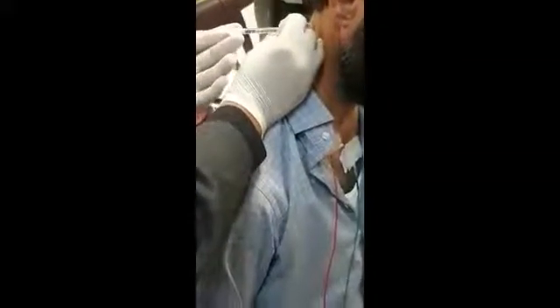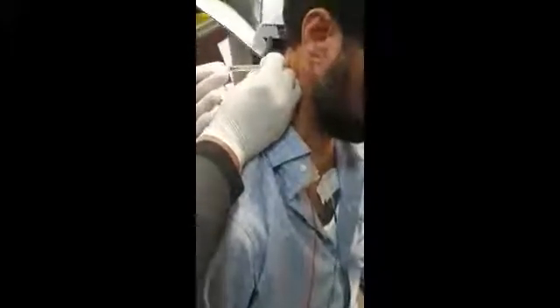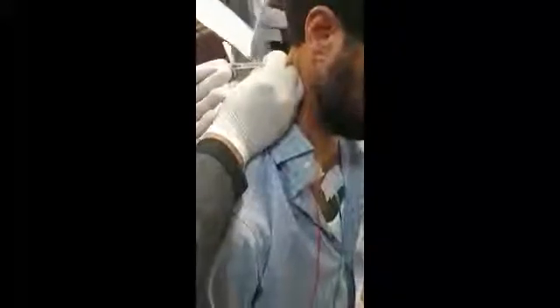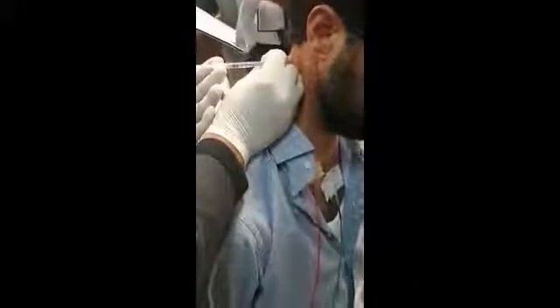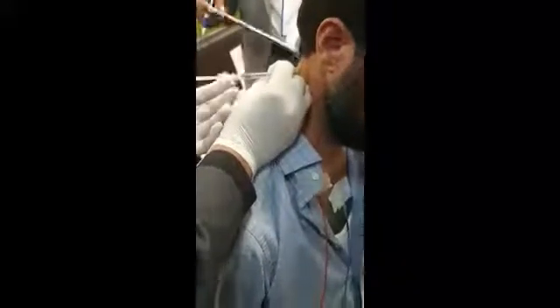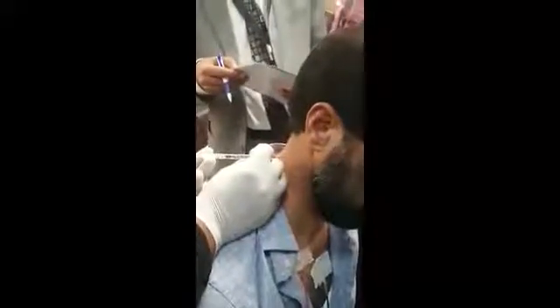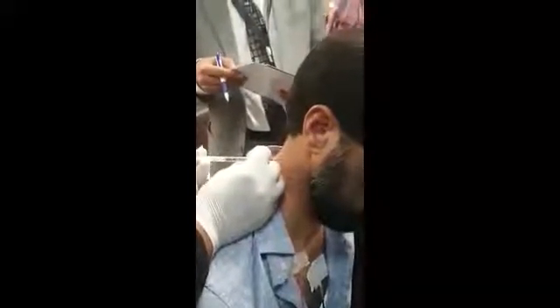The semispinalis capitis is a weak rotator, but it rotates contralaterally, just like the SCM — it rotates the head to the opposite side. These muscles can be injected in one go because they're in different layers: splenius capitis is more superficial and semispinalis capitis is deeper. The typical location is the groove between trapezius and SCM on the lateral side of the posterior neck.